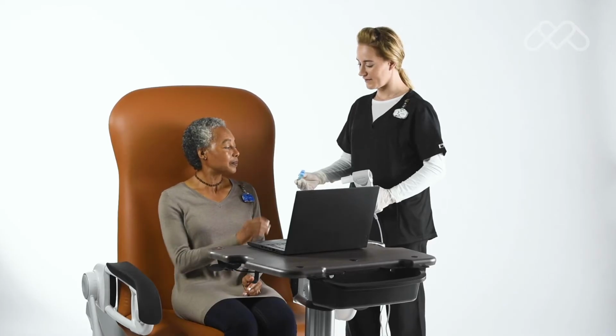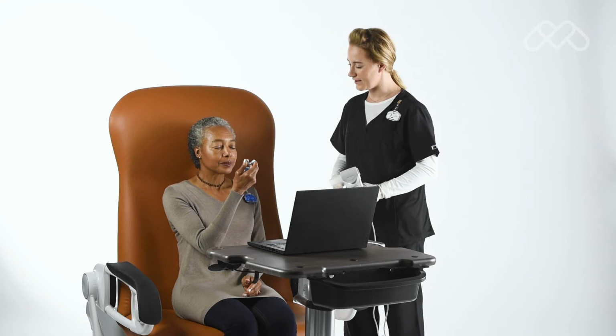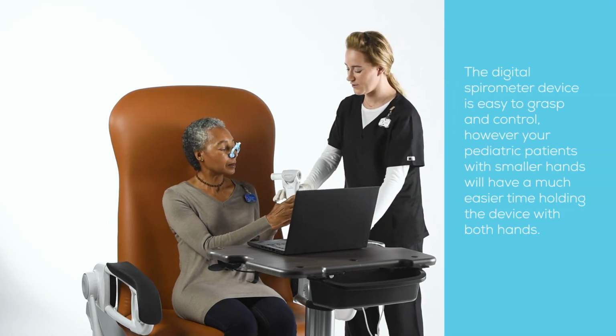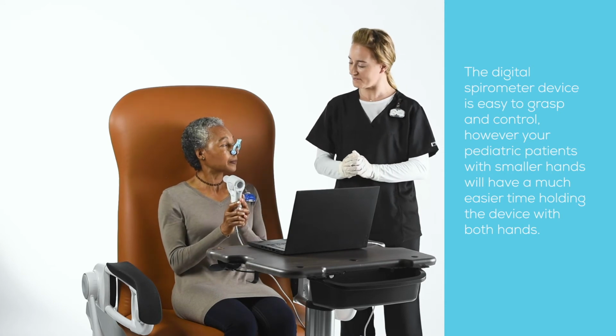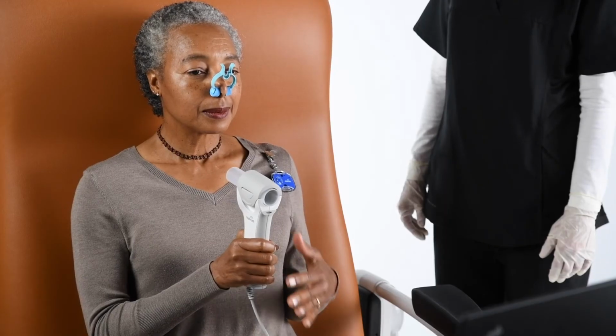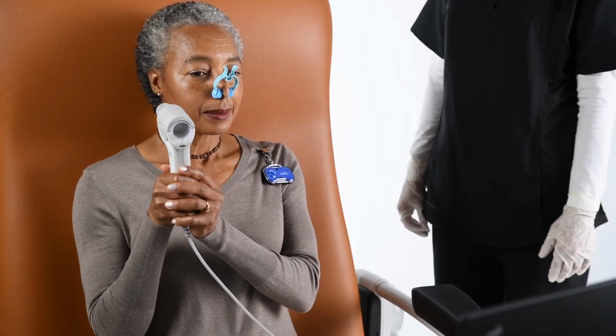Hand your patient nose clips and have them put them on. Then, hand them the digital spirometer. The digital spirometer is easy to grasp and control. However, your pediatric patients with smaller hands will have a much easier time holding the device with both hands. Instruct the patient to hold the spirometer up and to the side of their face.